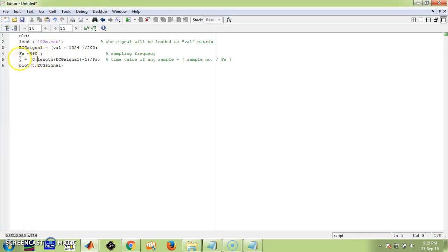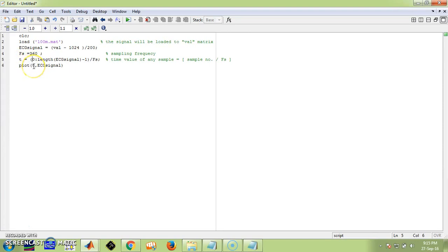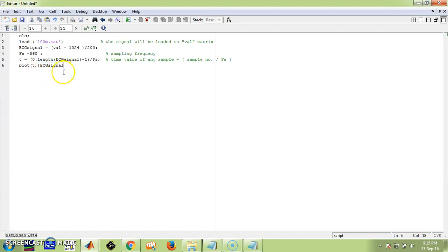Using this formula, we will automatically get the time vector. Now I am going to plot the X-axis variable versus Y-axis — plot the different time instances on the X-axis and the magnitudes of the different signal samples on the Y-axis. So the X-axis will automatically be time, and the Y-axis will be the ECG signal samples in millivolts.